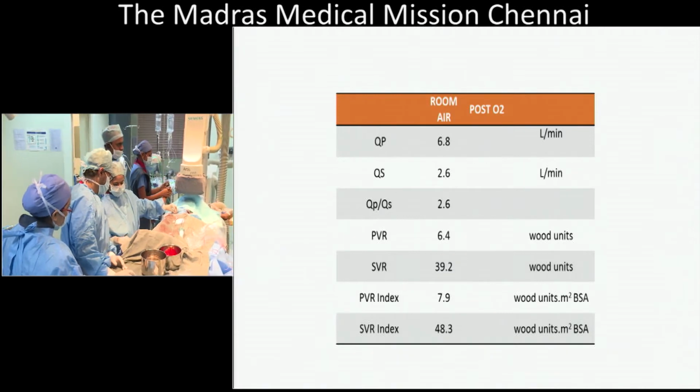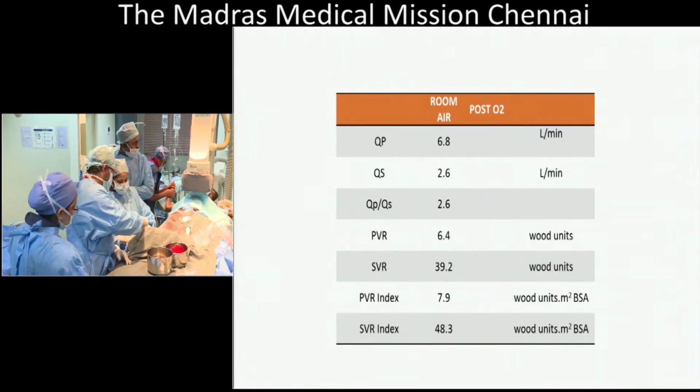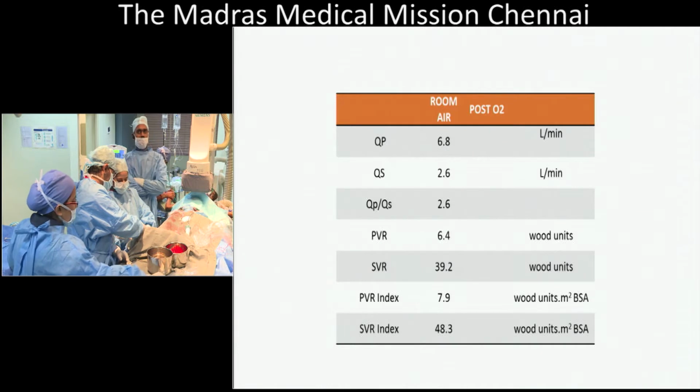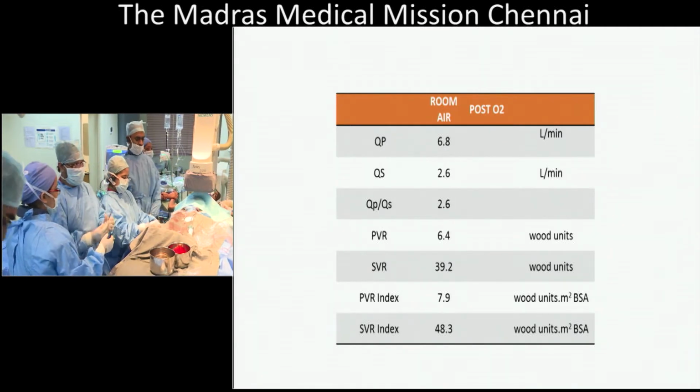Another short comment. It depends where the patient comes from. If he's from high altitude, I would definitely go with fenestration. I suspect this is low altitude. Yeah, it is a low altitude, in South India. Most of the places in South India are of low altitude.